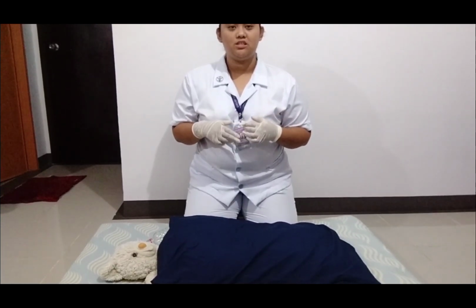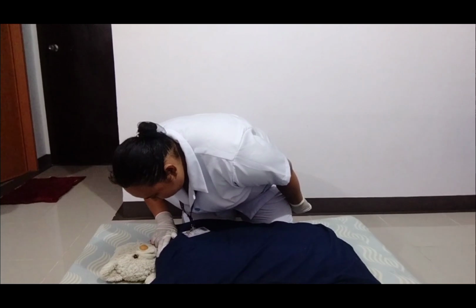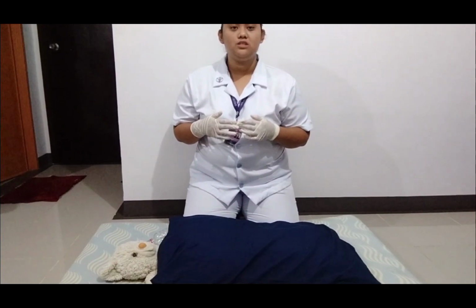Now, after doing that, continue doing the cardiopulmonary resuscitation for at least 5 cycles and then check the patient for the signs of return of circulation. 1, 2, 3, 4, 5, 6, 7, 8, 9, 10. Now, if the patient already has return of circulation, we have to place the patient in the recovery position.